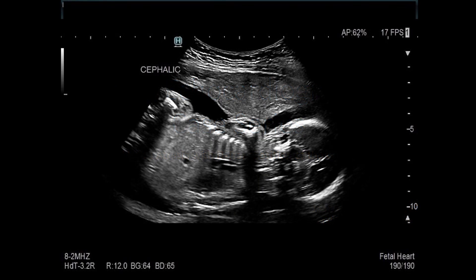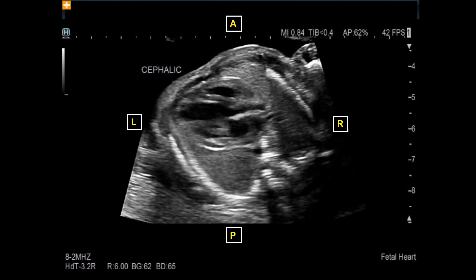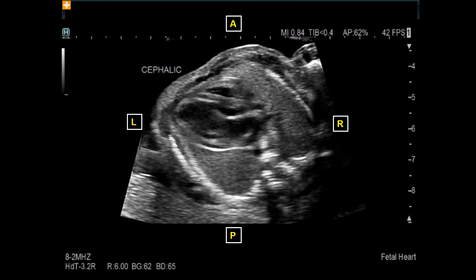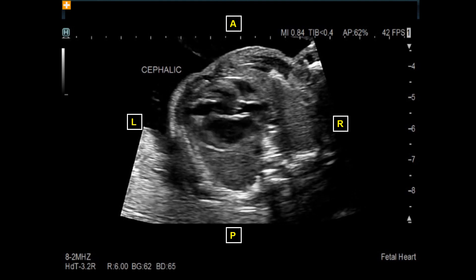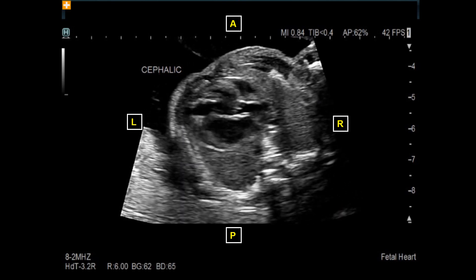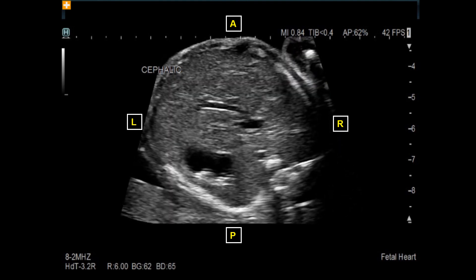As with our protocol here at Children's of Atlanta, we start with the transducer on the maternal abdomen with the index marker pointed cephalic toward mom's head. In this case, this fetus is in a cephalic presentation. We then transition to a transverse view through the fetal abdomen and thorax by rotating the transducer counterclockwise 90 degrees, pointed at the maternal right side.